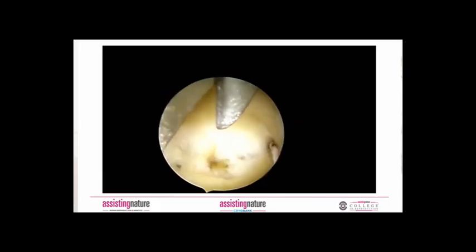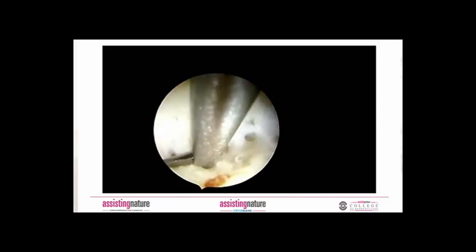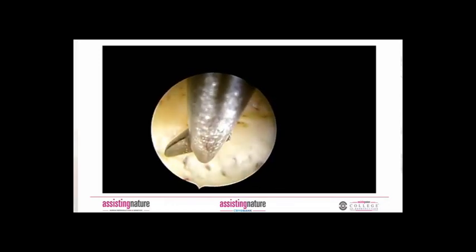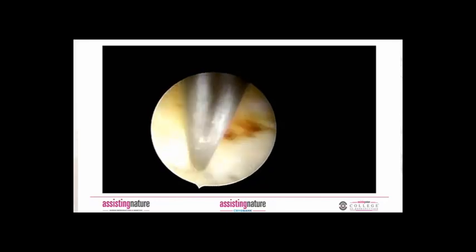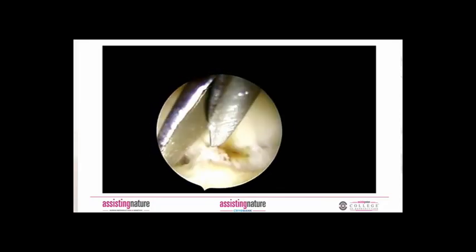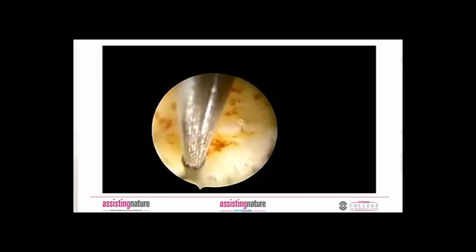I choose the middle stage, and as you can see, we are working with the scissor a little deeper, creating the cutting line from the one ostium to the other. This is the final view.